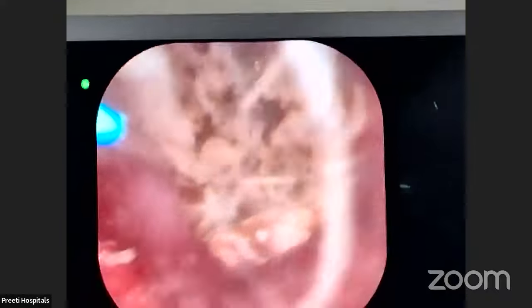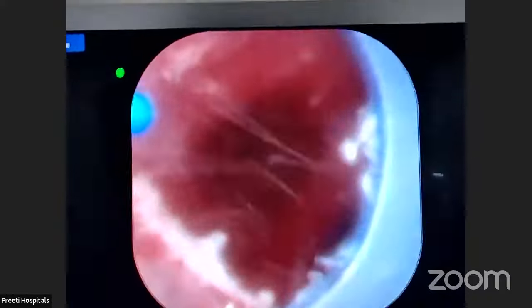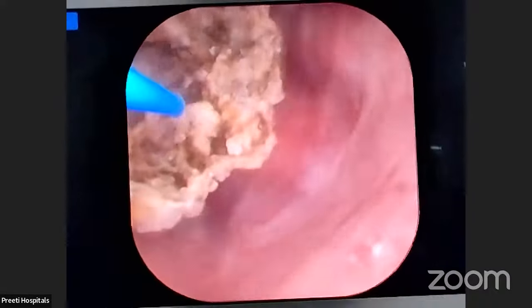Nothing will happen to the scope. Now the sheath is here at the infundibulum. Now you can do fragmentation mode also, with high energy. High energy we can use.